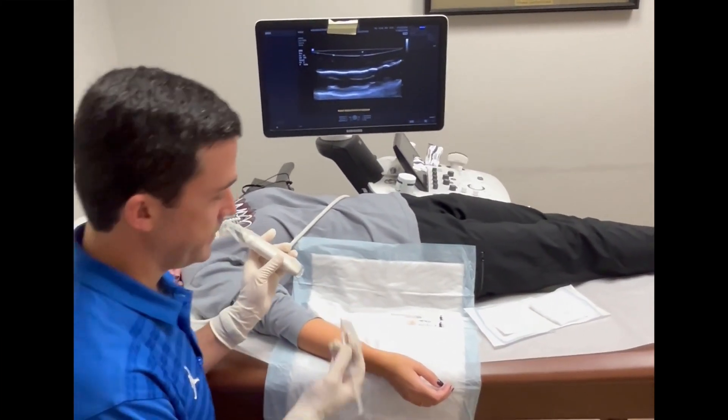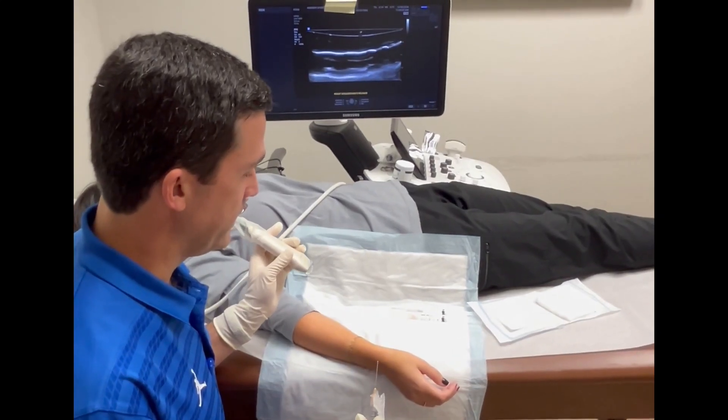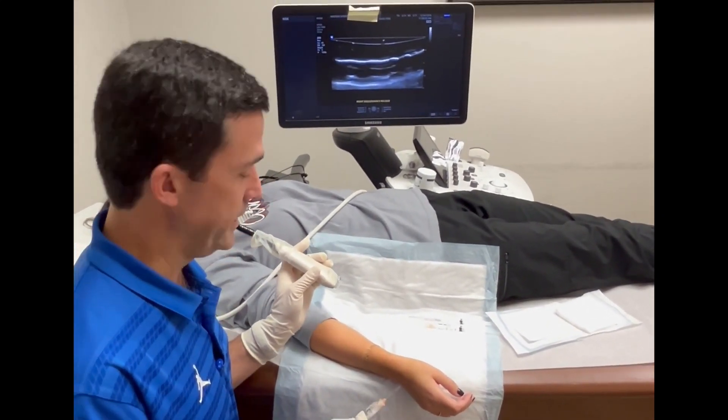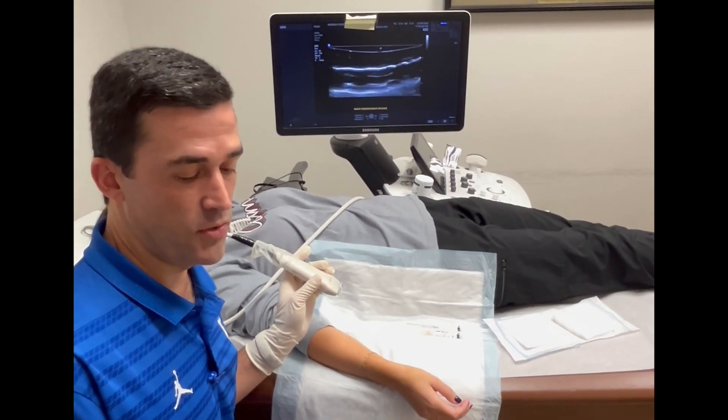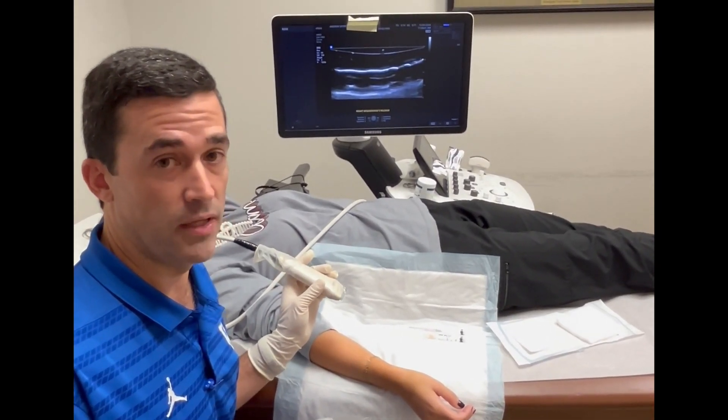I prepped everything in sterile fashion with betadine and alcohol, and we're going to be doing an anesthetic nerve block to the superficial radial nerve using a mixture of lidocaine with marcaine.